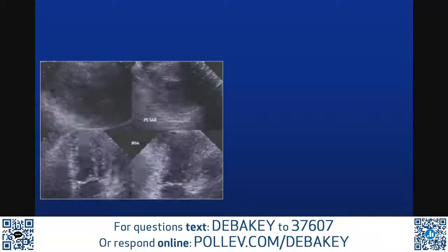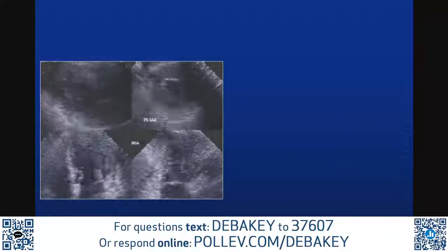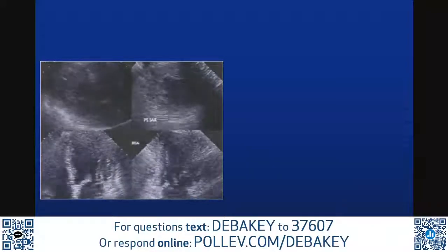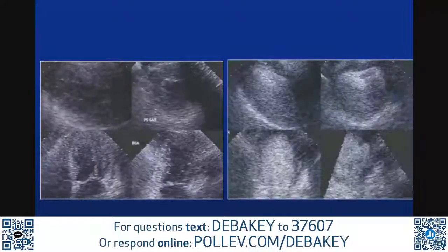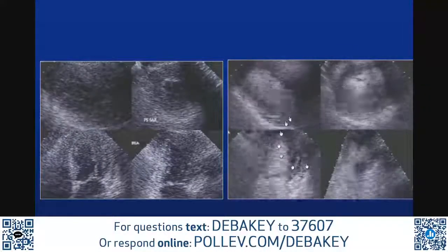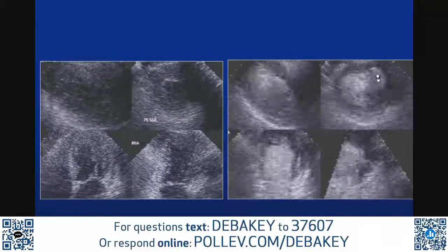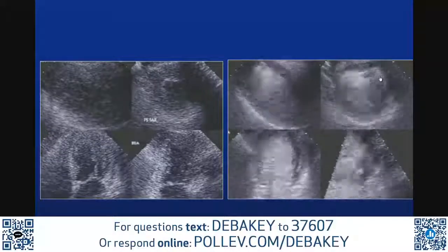And Dr. Kleiman, our interventional director, said, there's no way it can be normal. The electrocardiogram shows an infarct. Can you please do something? So we brought the patient back and used contrast. And the interesting thing, as you can see, is that there is a very unusual localization of what turns out to be an aneurysm in the lateral wall.